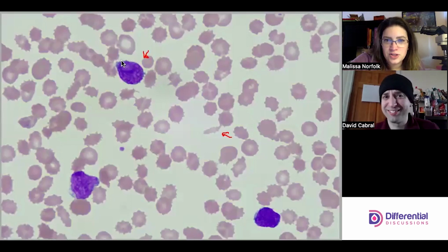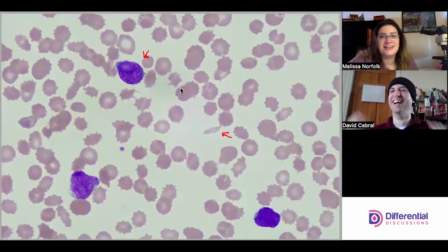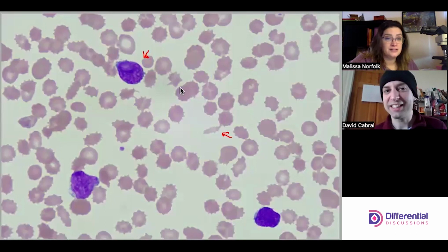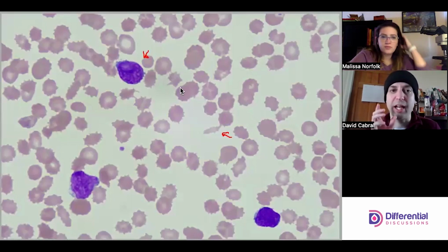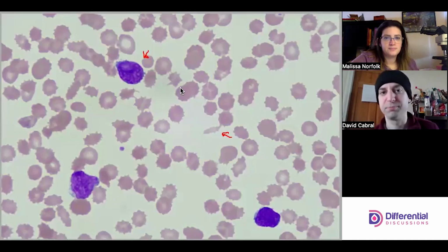And then you've got this giant, I don't even know what to call it, right? Yeah, it's weird. I don't know what it is either. Maybe it's a giant nucleoli. I think the word that if I had to attach to it would probably be that, but it's really indeterminate. It's just a very unusual thing for a nucleus to do. Yes. So yeah, that's an easy blast right there.